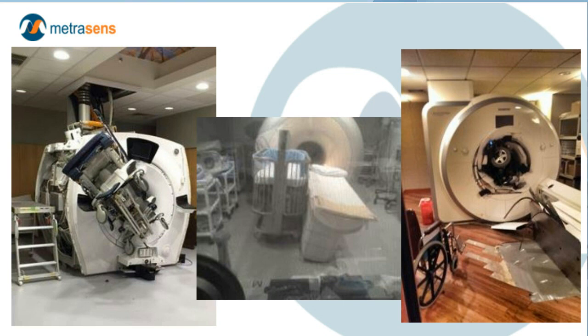Inside the bore, the tunnel of the MRI, you're seeing the remnants of that device that got sucked in there and completely knocking the floor-mounted MRI patient table off to the side. So here we have three fairly dramatic illustrations of the ways in which the physical facility can precipitate a set of decision-making that leads to projectile-related accidents. Projectile accidents are not the only ones, but they're ones with really profound visuals, and I hope that these pictures help to reinforce this point for you.